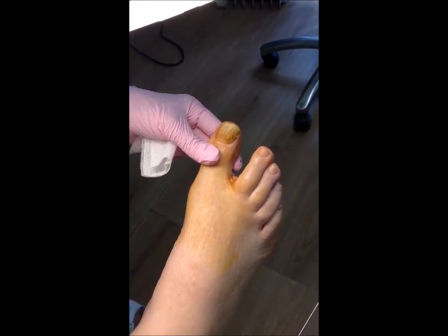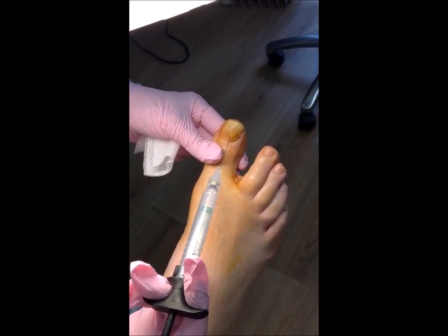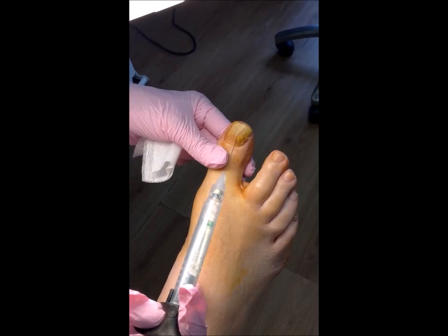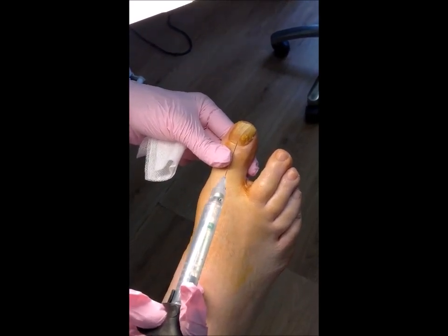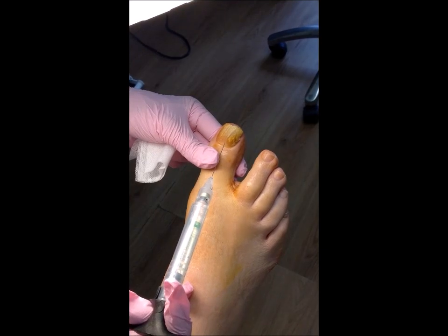One a week over a period of a month to encourage new healthy nail growth. If you look closely at the nail, you will see an area here that is very densely discolored — very yellow — and that could well be a dermatophytoma, which is an area of compacted fungal colonization and infection. These are very, very hard to treat.